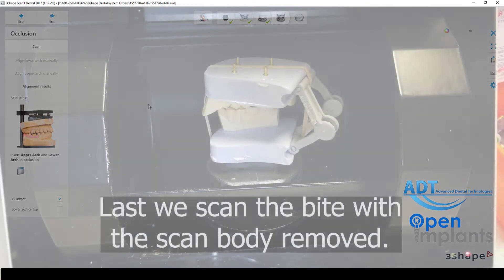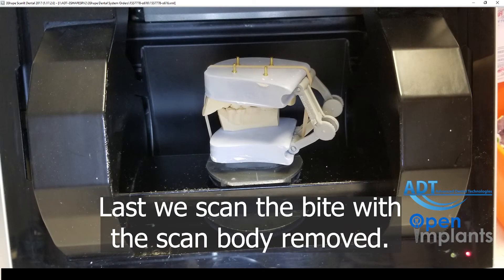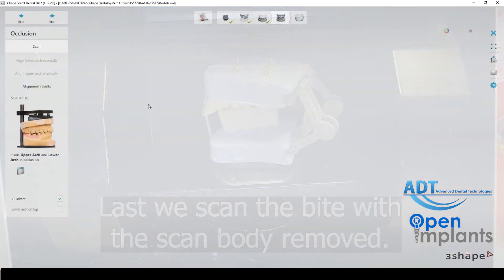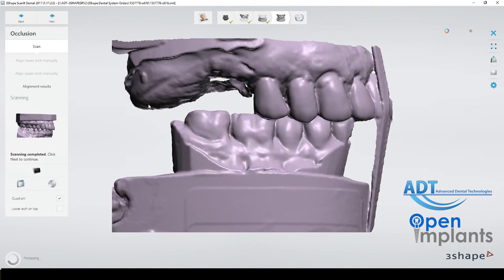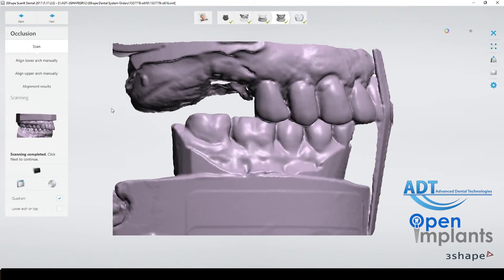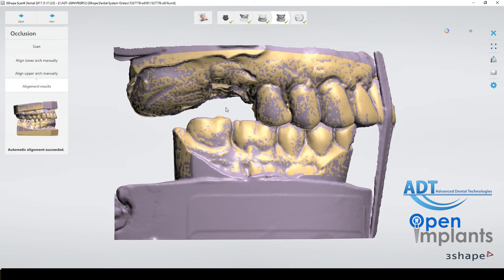Last we have the bite scan. We load this into the scanner. Scan body is removed. We just needed that for the preparation scan and let it scan.